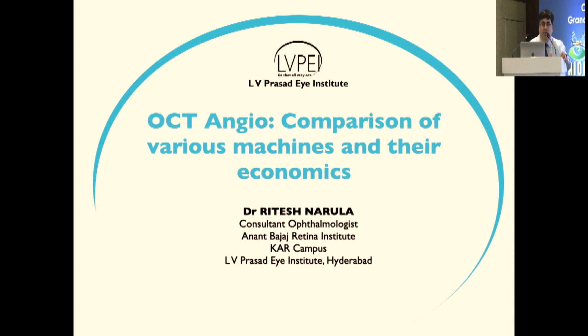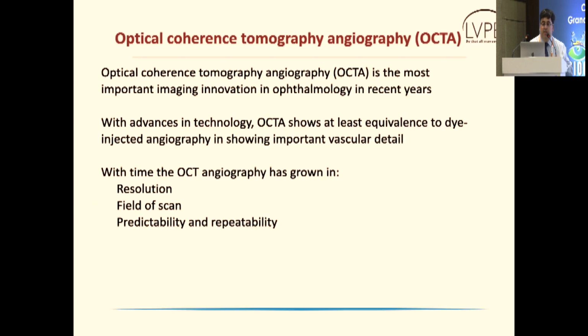I am going to be touching upon these machines not in a very theoretical manner. I'll try and just give you a brief overview of how these machines differ from each other, and then you can take your best call as to what suits your practice. OCT is a very important imaging innovation in ophthalmology in recent years. It has grown in leaps and bounds.